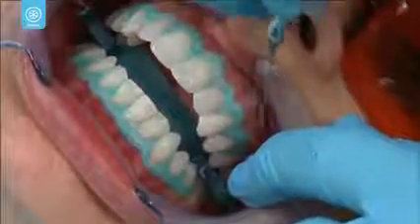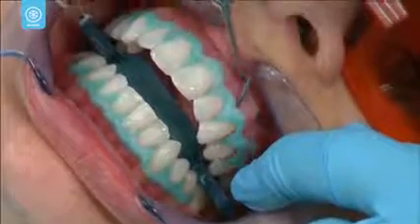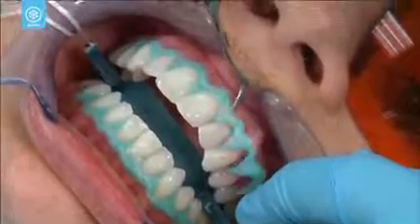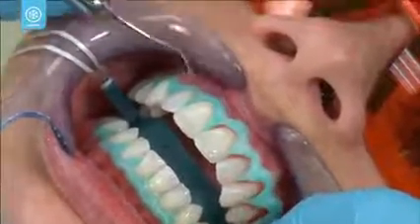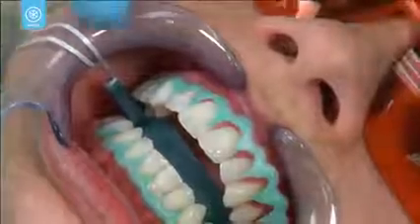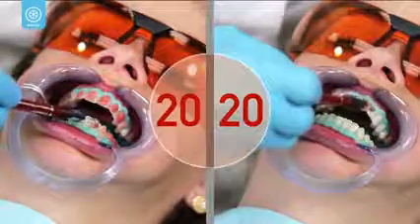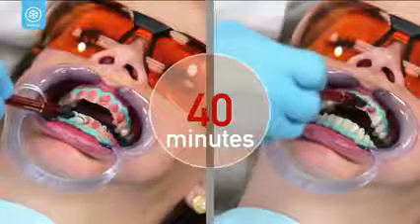Following the final application, the resin barrier is easily removed. Because Opalescence Boost begins to work immediately after it's placed on the teeth, the total whitening procedure is fast, typically lasting less than 60 minutes. This includes two 20-minute applications of Opalescence Boost for a total of 40 minutes of whitening time.